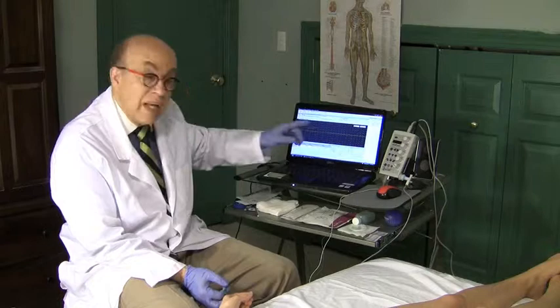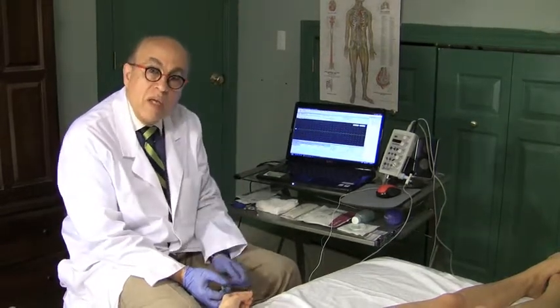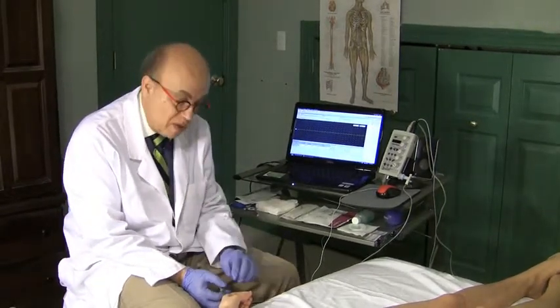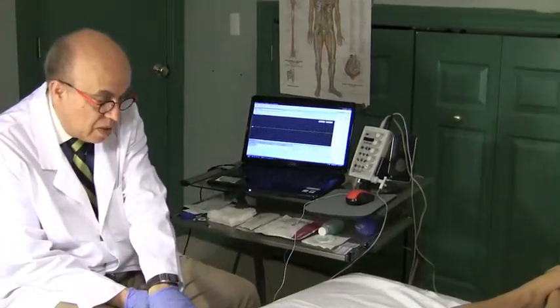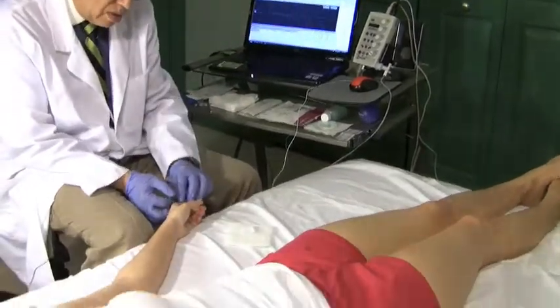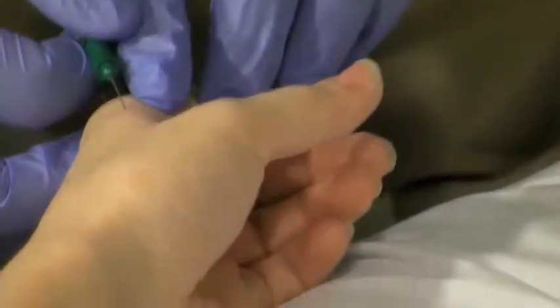Now I want you to focus. And the second thing that it could be, could be fibrillation and positive waves. Fibrillation and positive waves are seen where the muscle is denervated. Here we go.